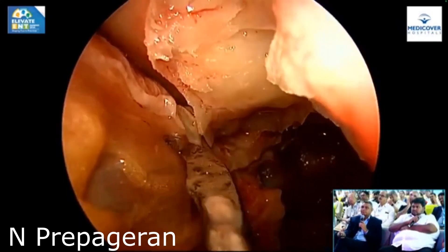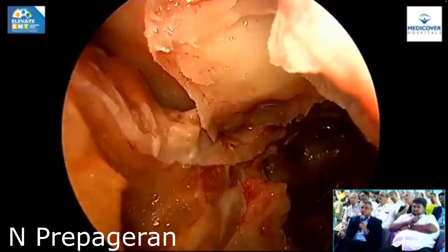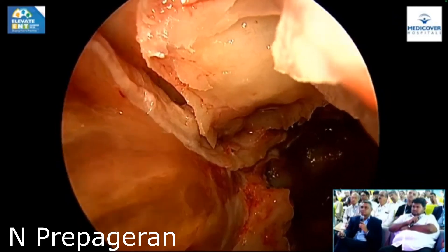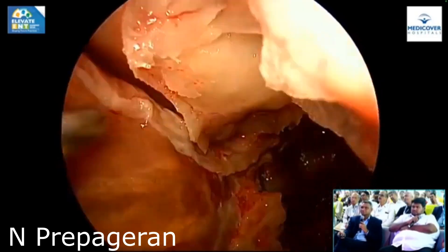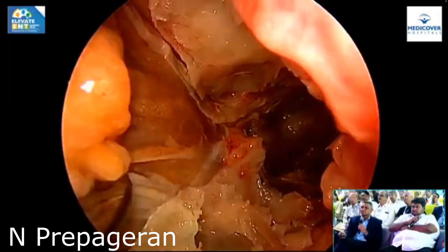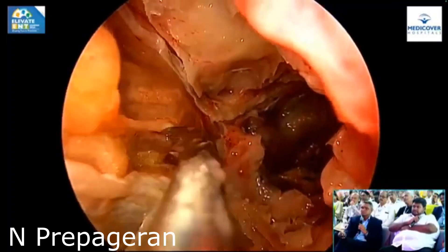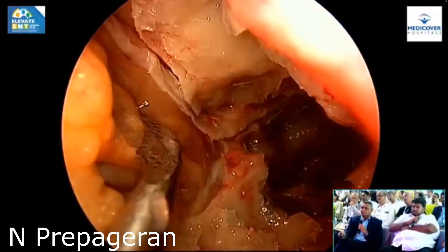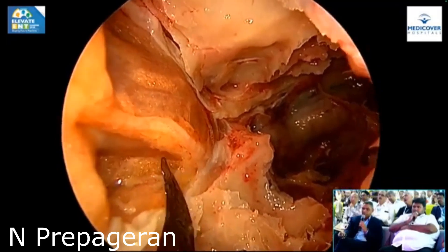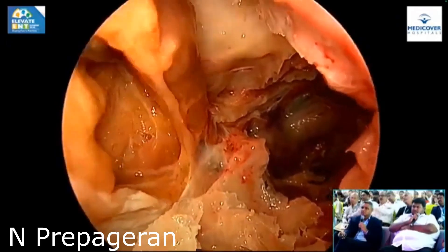If I go a little bit above I should be able to identify the superior oblique as well. The junction is just about here — the junction of the medial rectus and the superior oblique. If you enter here, you can go intraconal to remove tumors. The same way, if we dissect lower down we should be able to identify the inferior rectus muscle. That's the junction between the superior and inferior limits of the medial rectus — that's the inferior rectus muscle. Now I'm going to cut this and go intraconal.